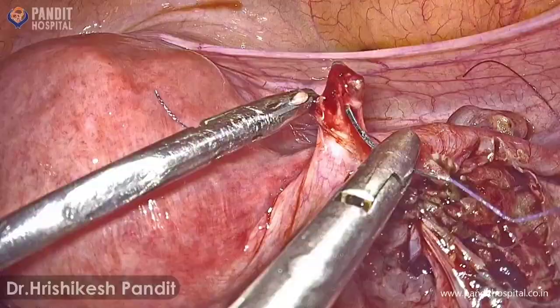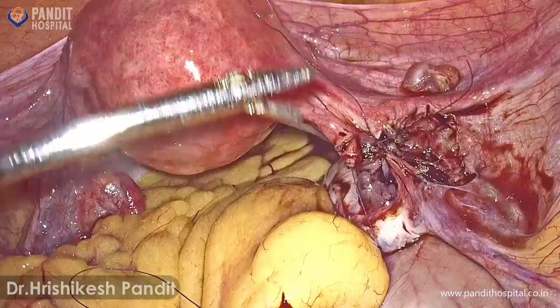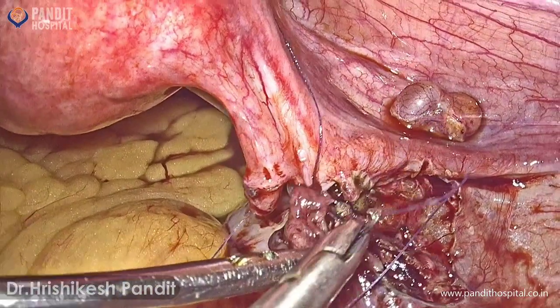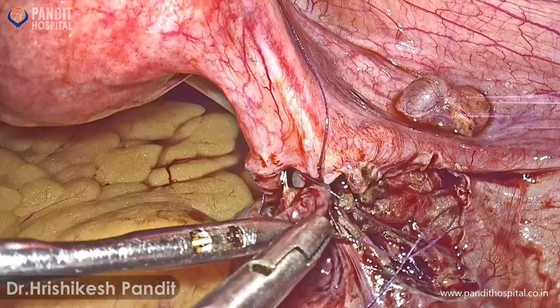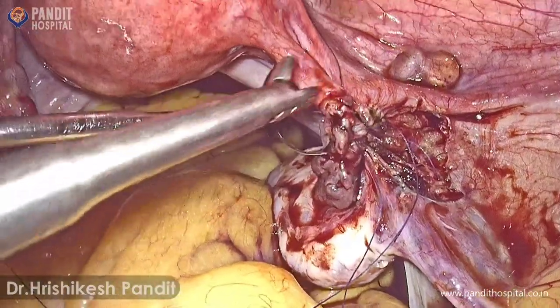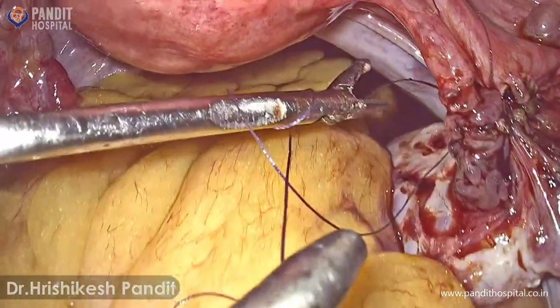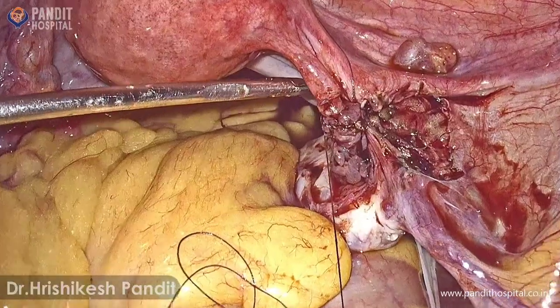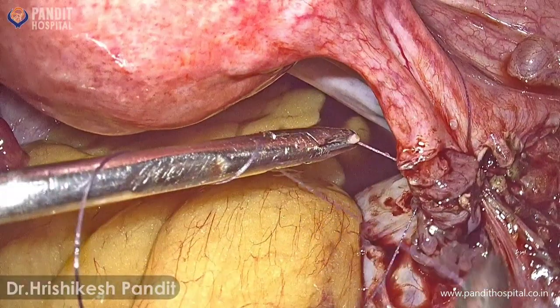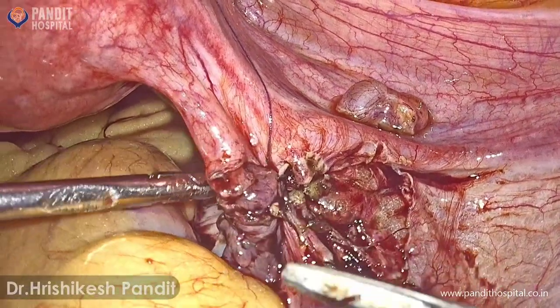The proximal end is really small. I am taking the 6 o'clock stitch from outside-in and now inside-out from the distal portion, taking the bite from the mucosa so that whenever we tighten all the stitches it should be leak-proof. We are going to use 5-0 Vicryl here, intentionally keeping the threads longer.